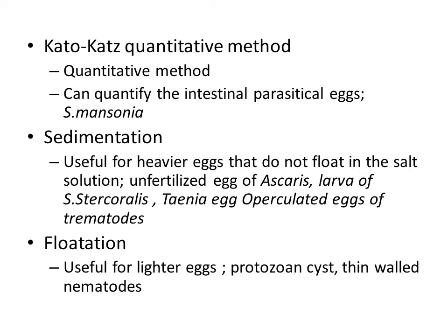In the sedimentation technique, we sediment the parasitic stages using a specific gravity solution that is lighter, that is, of low specific gravity compared with the parasitic stages, so the parasitic stages are deposited.